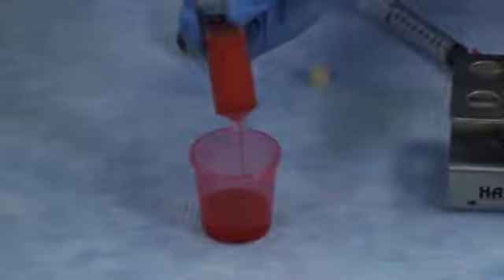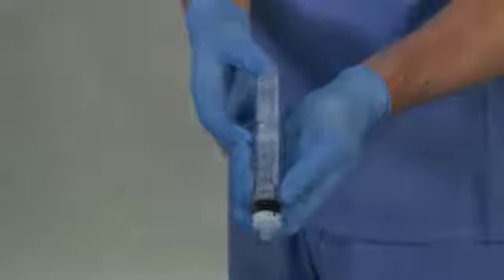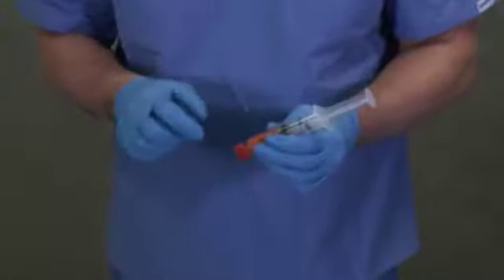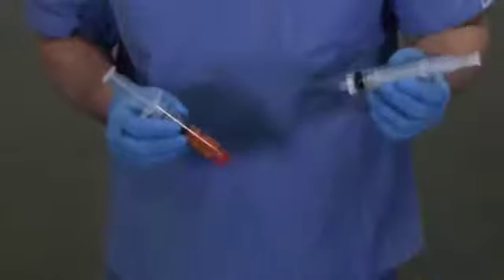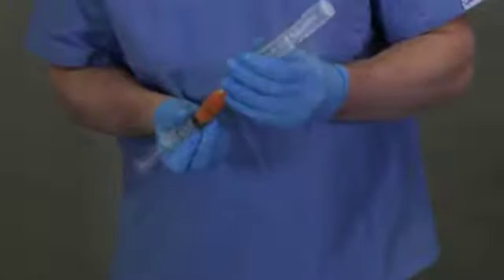Prior to transferring a lipoaspirate to the process disposable, be sure that the disposable plunger is completely depressed and flush with the lipid barrier disc at the bottom of the syringe. Attach a female-to-female connector to the collection syringe. Attach the process disposable to the collection syringe via the female-to-female connector.